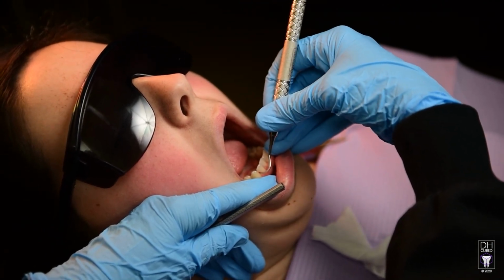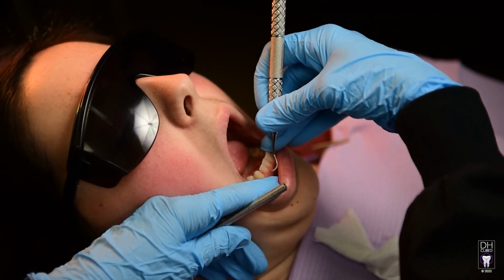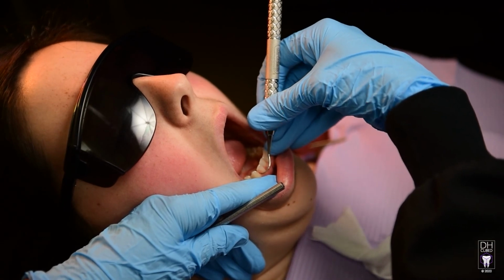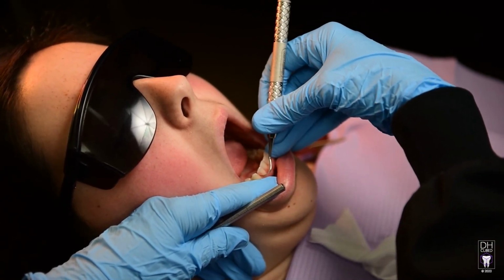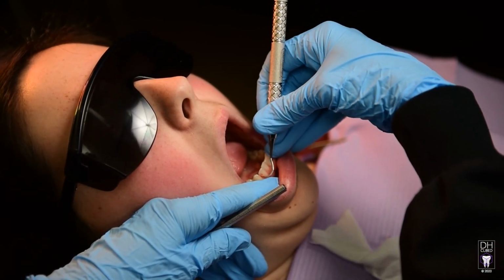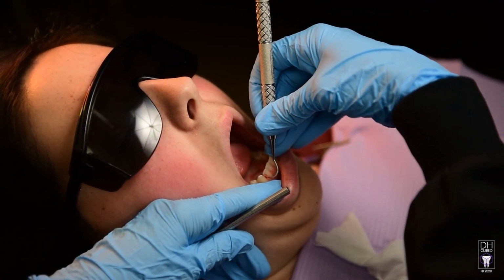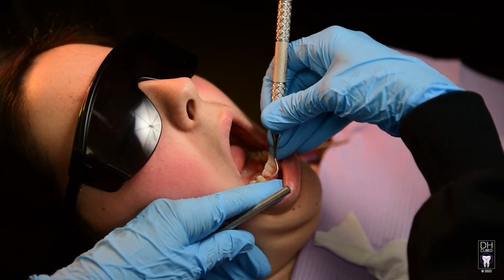If you find yourself pressing harder and or closing the blade farther and farther, these are the first signs of dullness and clues to stop and sharpen. Break yourself of the thought, I don't have enough time to sharpen. This is the very mindset that will keep you from sharpening at the first sign of dullness. Working with dull or poorly sharpened instruments is one of the leading causes of hand injury to the hygienist, and the best care is not being provided to the patient.